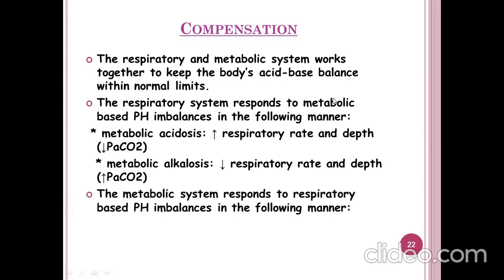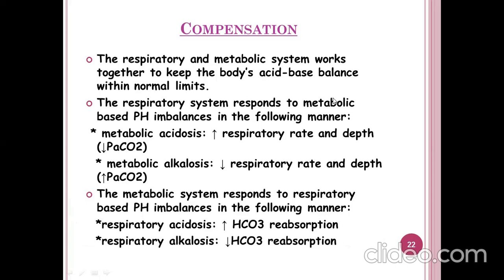The metabolic system responds to respiratory-based pH imbalance. That means if there is an alteration in the respiratory system, meaning the lungs, the metabolic system responds. Okay, so what happens? In respiratory acidosis, bicarbonate reabsorption is going to increase. In respiratory alkalosis, bicarbonate reabsorption is going to decrease.